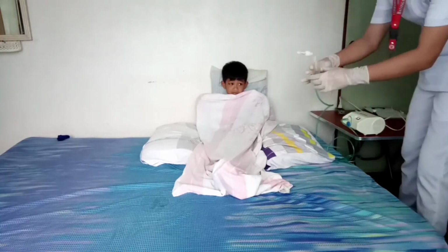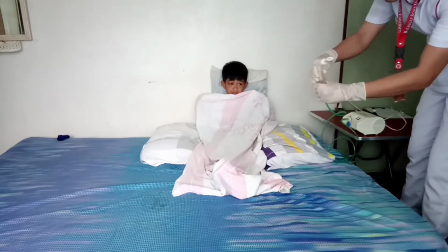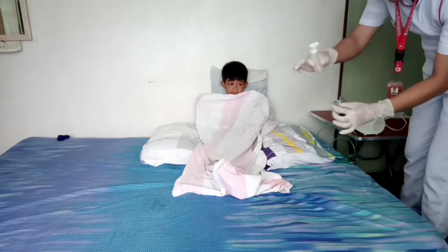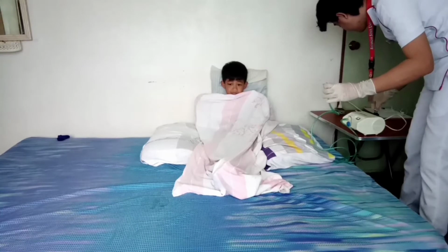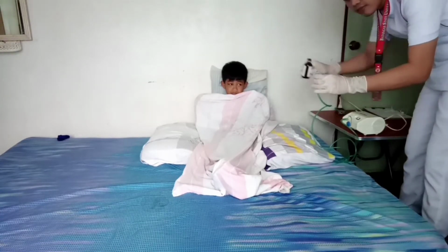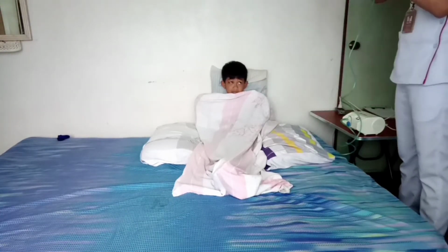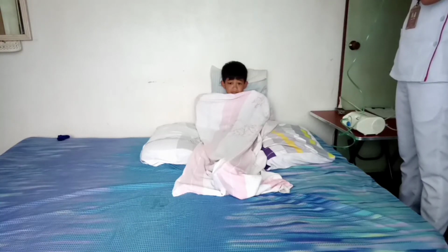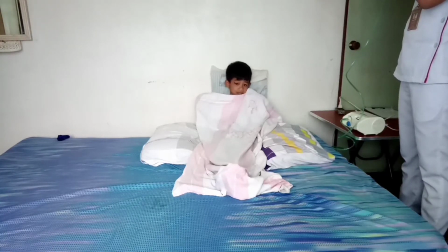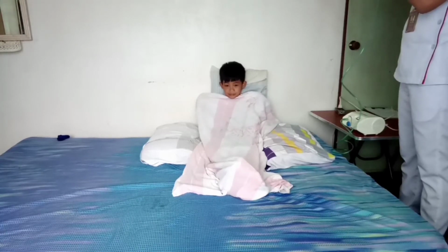And then remove the cover from the neb cup, pour the ordered amount of medicine into the cup, and reattach the cover. Be sure to perform the right 6 of giving medication. Right patient, right medication, right dose, right route, right time, and right documentation.